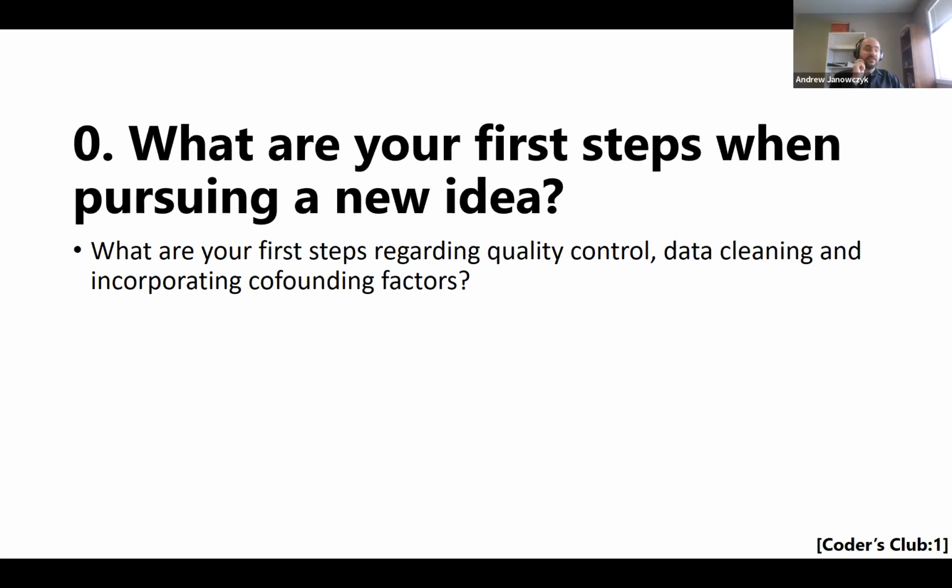I think it's worth pointing out that you don't even have to wait until you have, for example, ground truth annotations to figure out if something has gone astray, right? Because if you run, let's say, a segmentation algorithm and 99% of the pixels in that output image are positive, you don't have to know that that's wrong, right? You have some first order statistical measures that you can also employ, just using morphological operations to try and find some of these outliers as well and address them sooner.